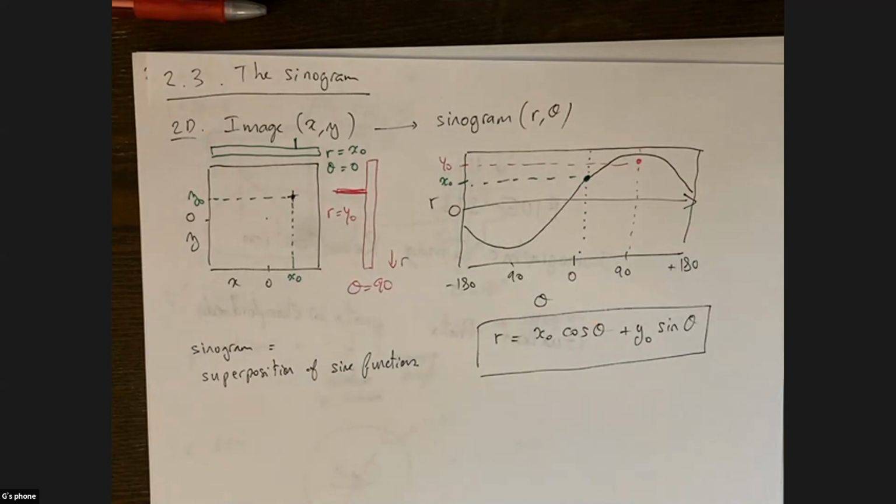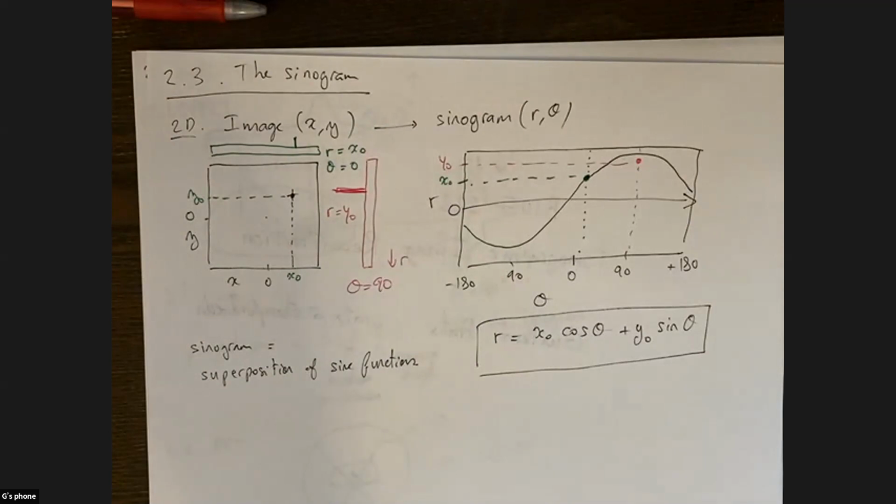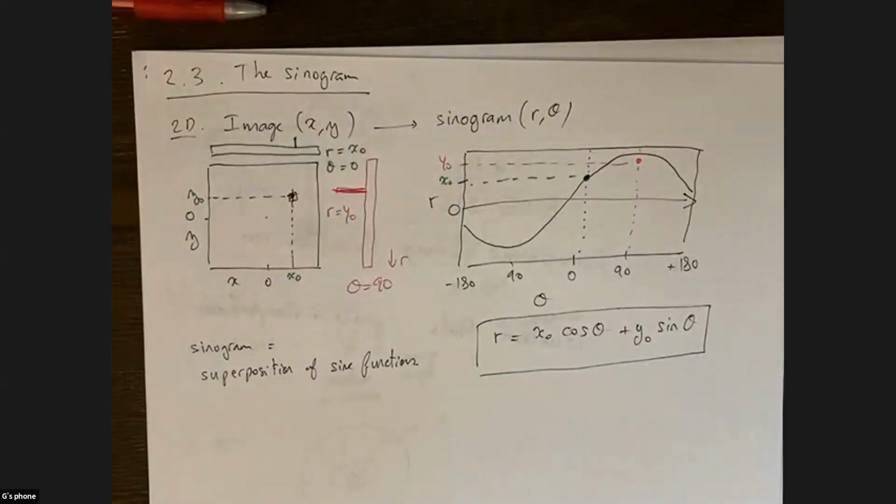When you said that when you have multiple sources, it forms a superposition, you said it was like getting added together. Why wouldn't it be like multiple sine waves? Well, it's basically an infinite number of sine waves, because if you think about an image, you can say an image is just the sum of punctual sources, right? So essentially you could call that a pixel in your image. Or you can decompose any two-dimensional distribution as an infinite sum of delta functions or point sources, right?